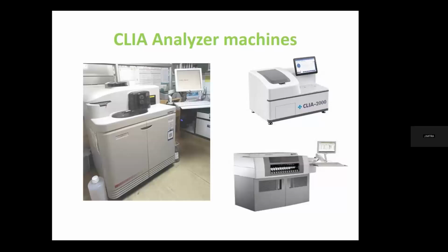These are different CLIA machines by different manufacturers. I gave two or three pictures here. All the machines are fully automated, and have an LED monitor with an inbuilt printer.